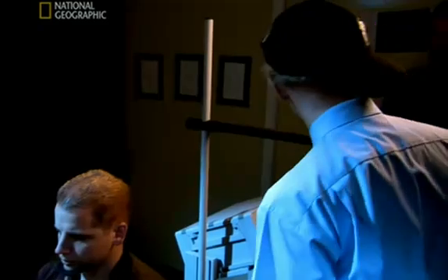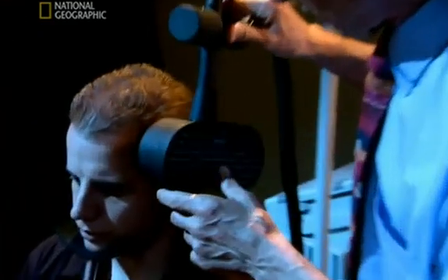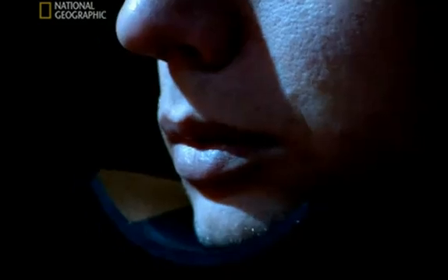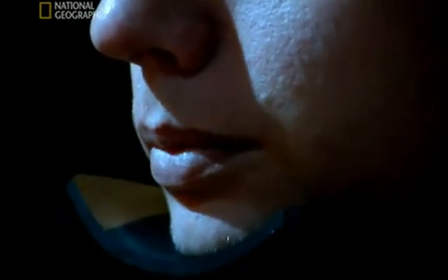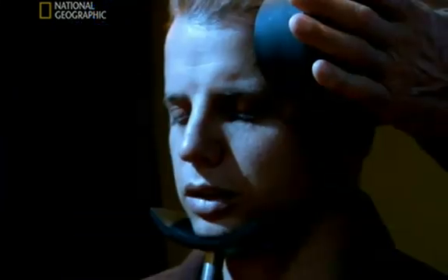Now Snyder is going to try to unleash his subject's inner savant. We're going to put the magnet on your skull, just where we measured before. It is very possible that you'll feel your teeth clenching together — what I suggest you do is hold them tight. We're going to do this for 15 minutes and I want you to try to hold still. It actually feels like a small pressure blow — like a ball-point hammer, some people say. The good news is that you're participating in a truly frontier experiment.